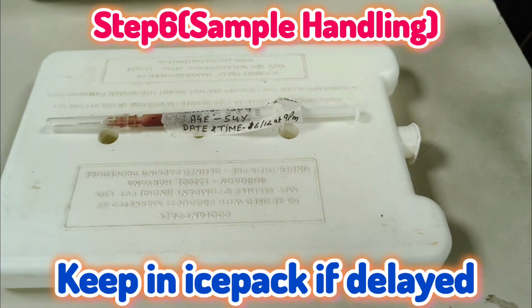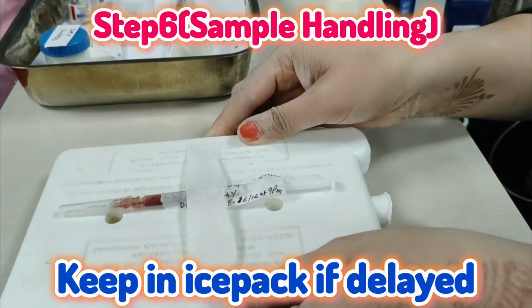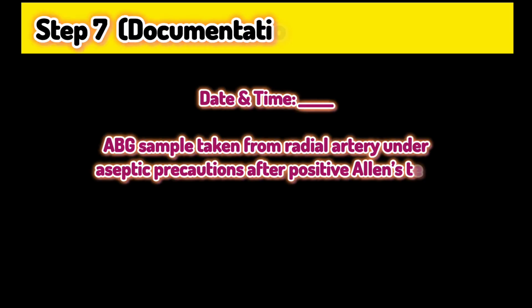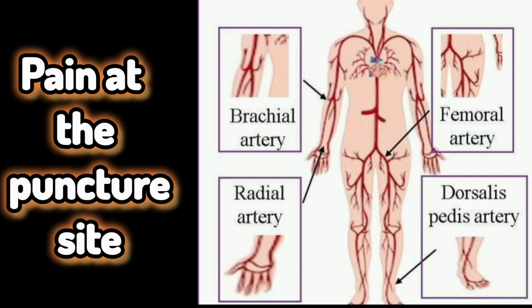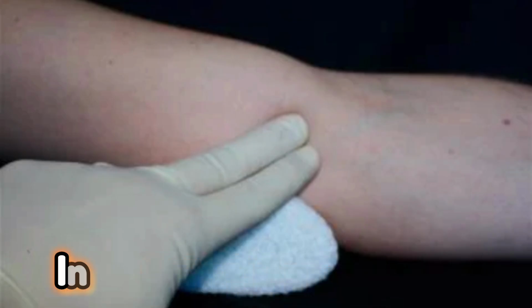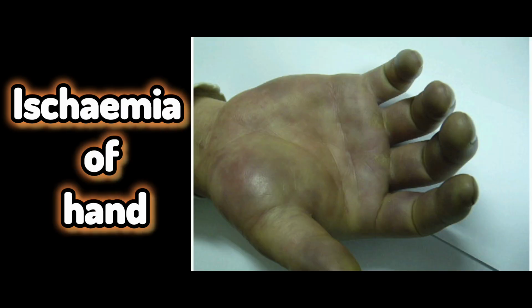If there is a delay, keep it in an ice pack and send it with proper labeling with patient's name, age, serial number, FiO2 and oxygen flow. Step 7. Documentation. Site used, time of sample, oxygen and FiO2 record, any complications. So what can be complications of ABG? Possible complications include pain at the puncture site, bleeding or hematoma, arterial spasm, infection, arterial thrombosis, and very rarely ischemia of the hand.